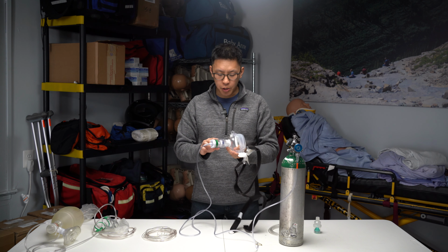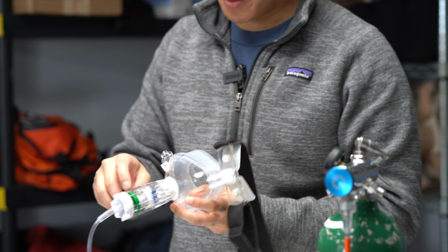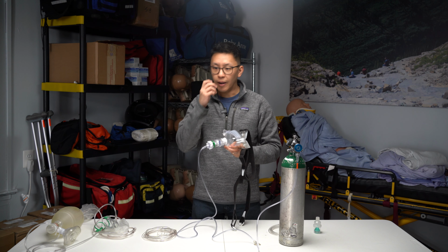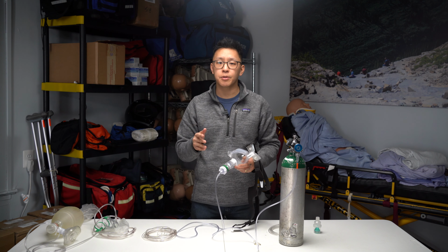The only thing we need to adjust is this PEEP level right here, and it starts at 5 centimeters of water, the next one up is 7.5, and the last one is 10 centimeters of water. PEEP, very quickly, for short, is positive end expiratory pressure.